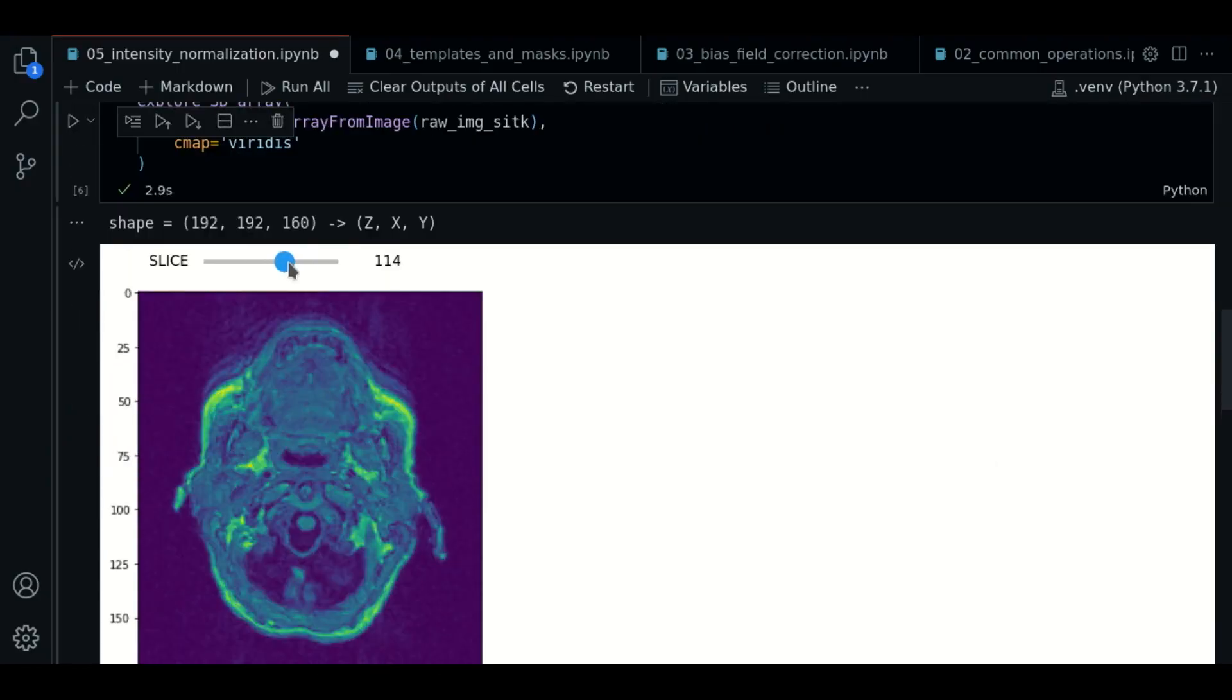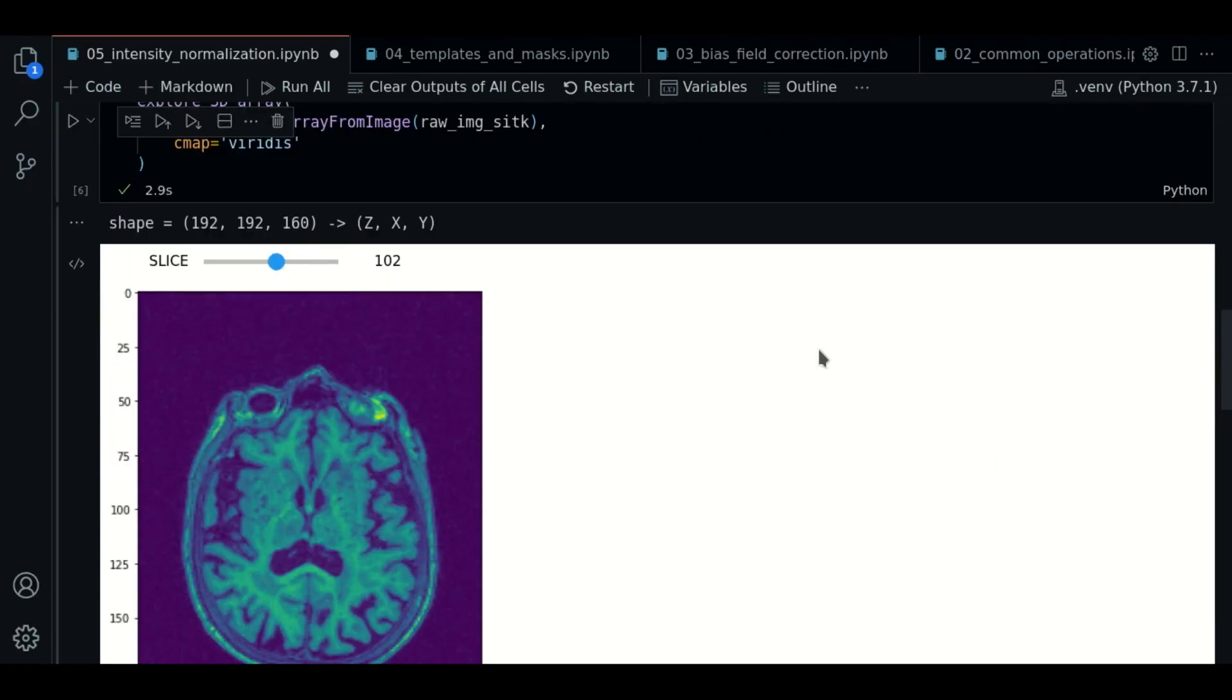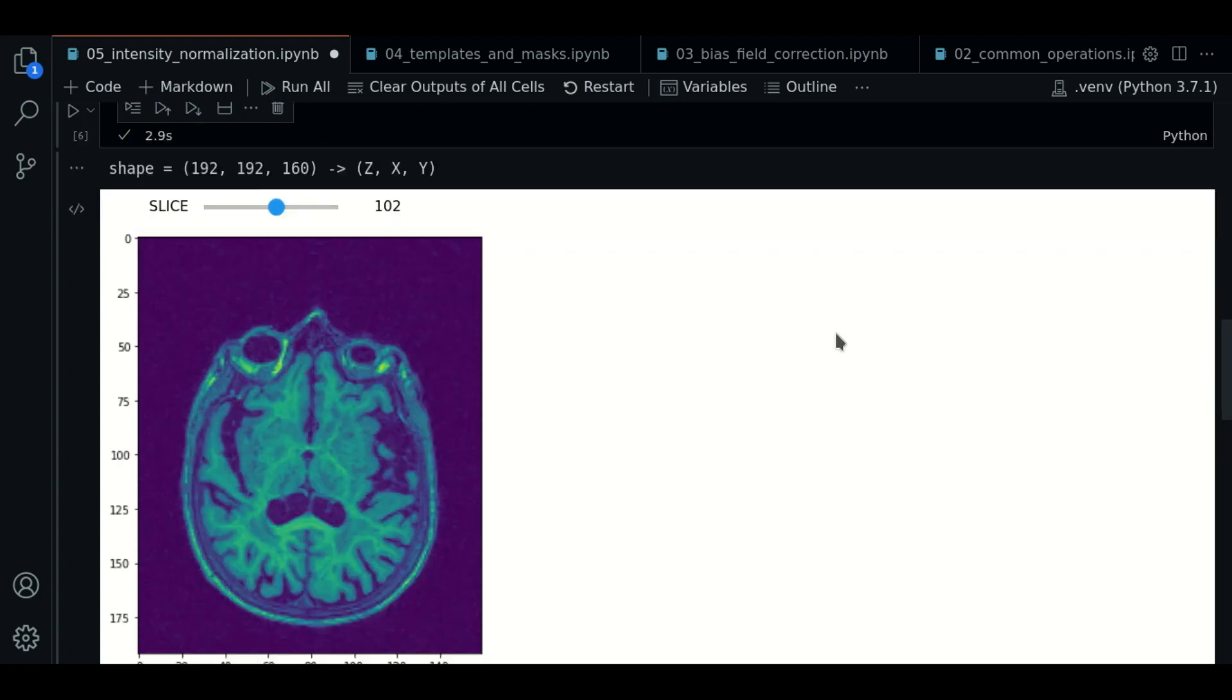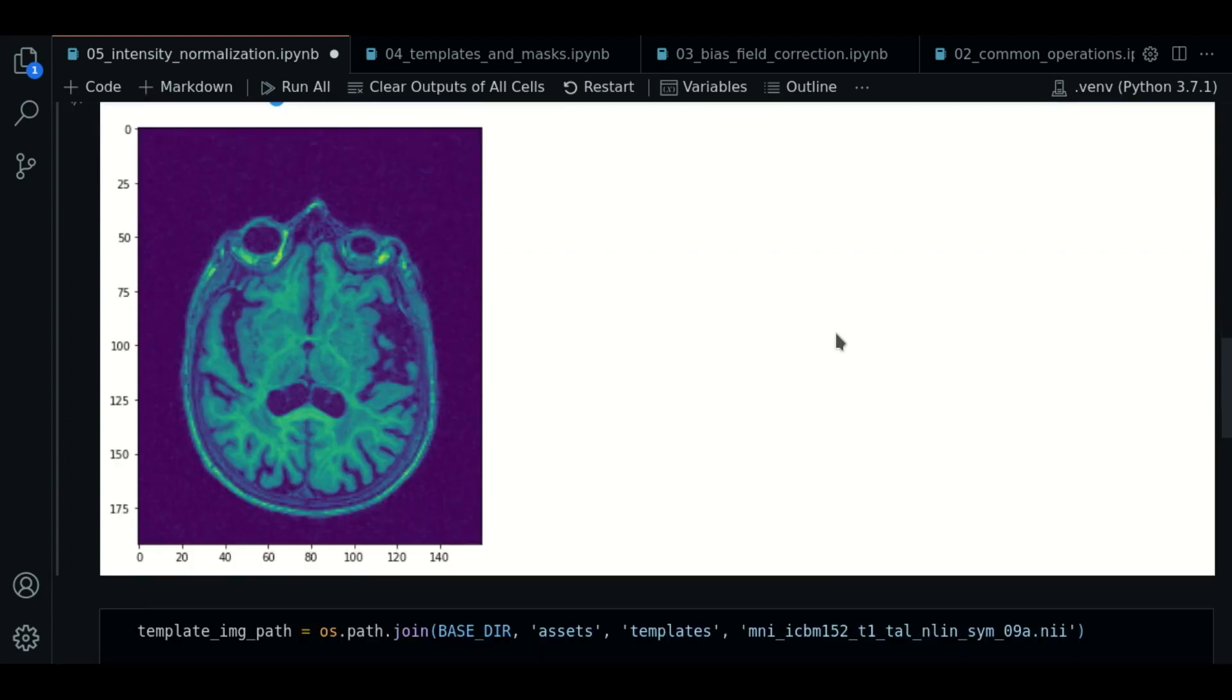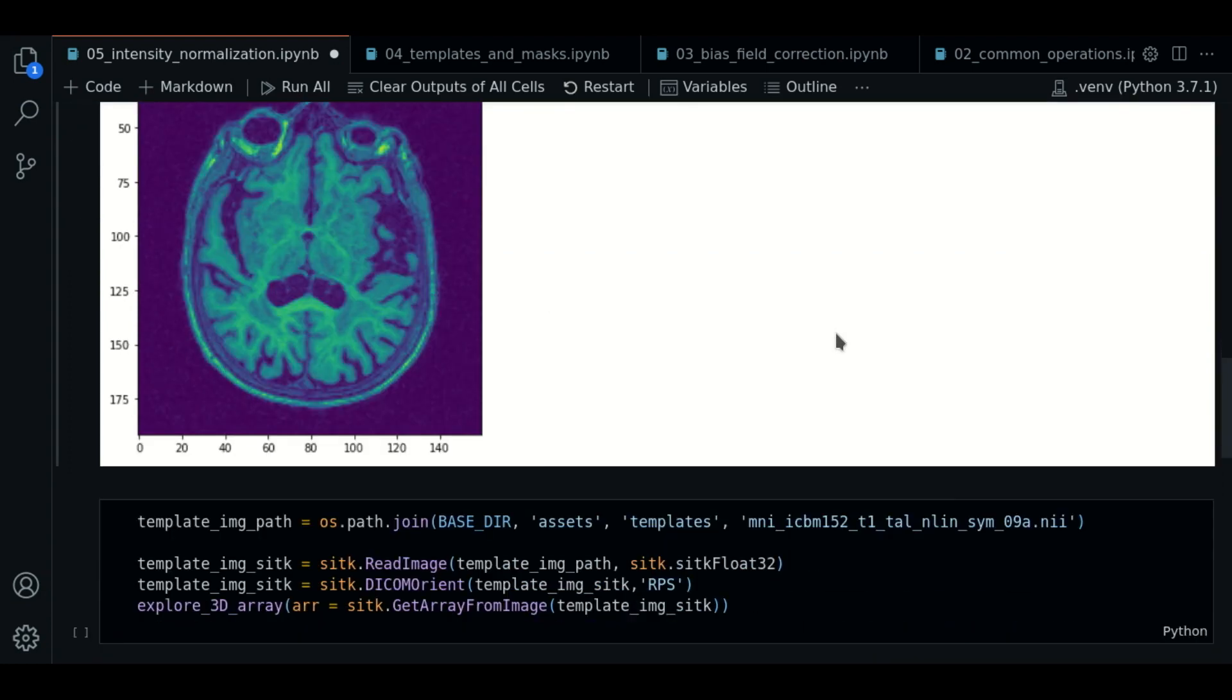So now we have loaded our raw example to work with. As I told you, the histogram matching method requires an image of reference. This is usually a template, and it can be any reference image, but usually it's a template.